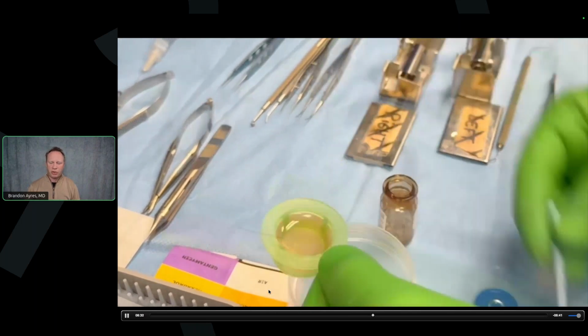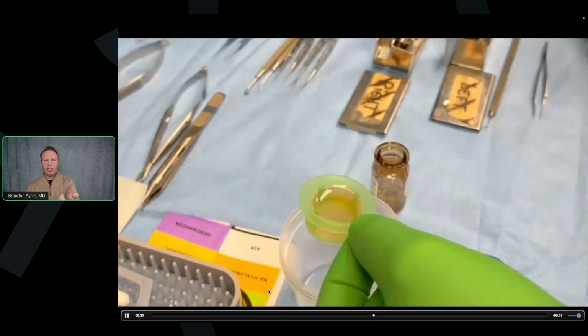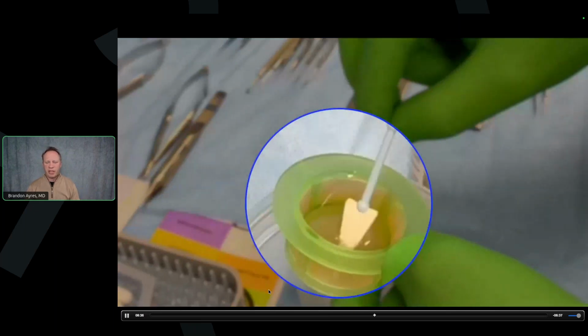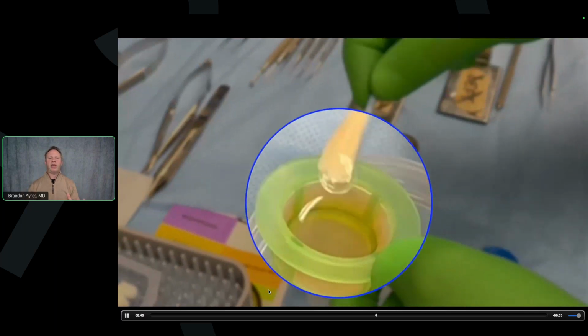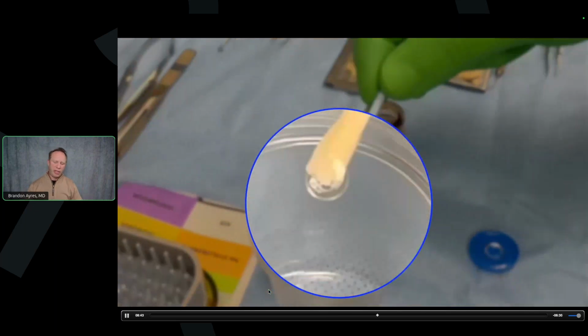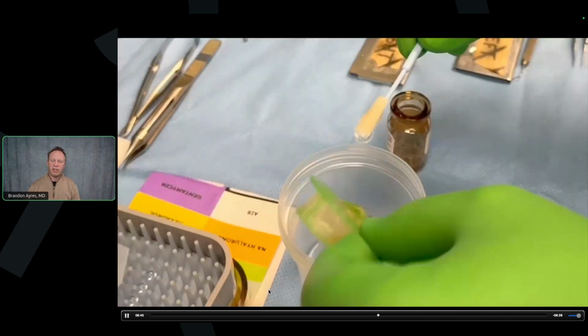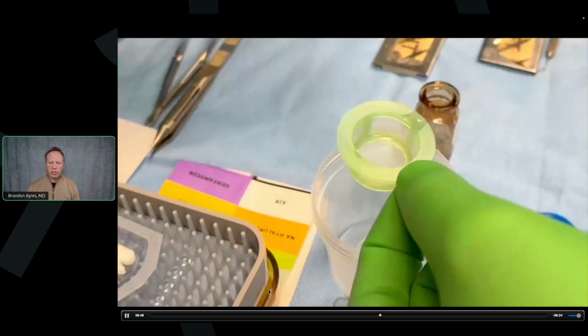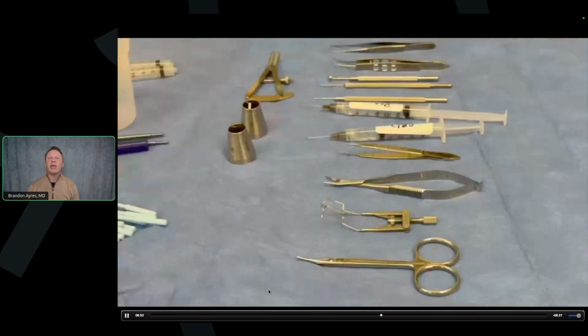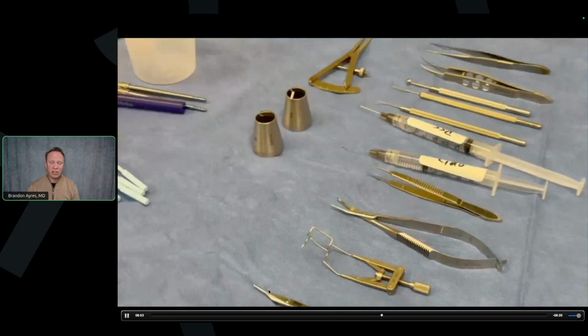So I'm kind of looking in the strainer. A little tip, if you just touch the bottom of the strainer, it'll strain much faster. Still looking. Where is it? There it is. Okay, we found our segment. Now we can move on with the case, and I'll move over to the patient once I find it. So this is step one. It's like finding Waldo. It's where's the CTAK segment? It's been in there every time. It's there. Trust me. You just got to find it.